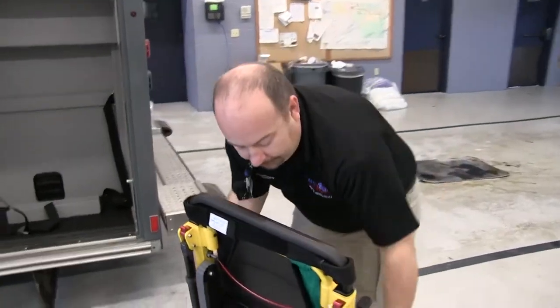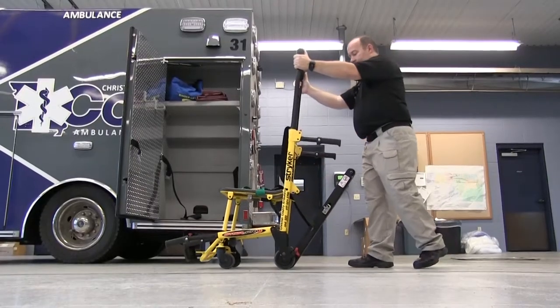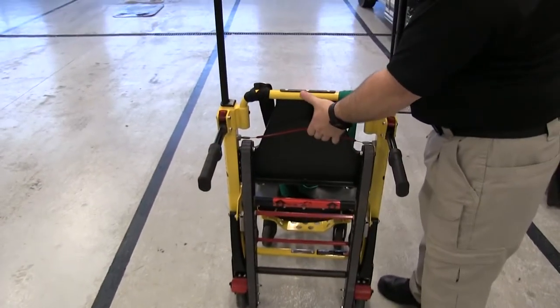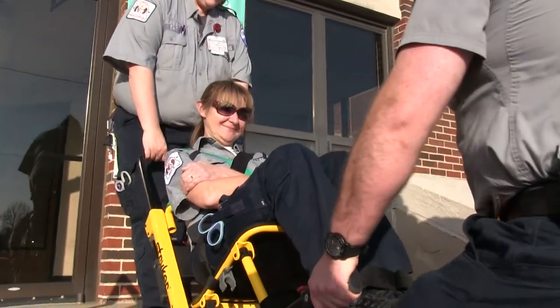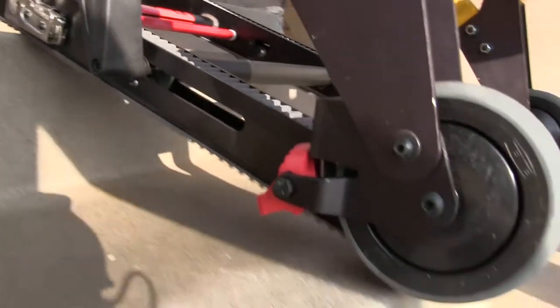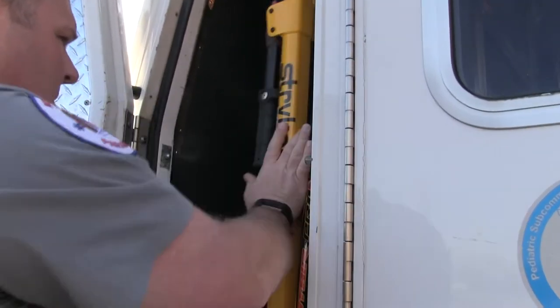It gives us quite a bit of versatility and movement. The Stryker Stair Chair weighs about 30 pounds, with a weight limit rated at 500 pounds. The upper arm provides better control while moving the patient down the stairs, with different locking positions for operator control, reducing risk of injury and ensuring patient safety. The handles at the foot of the chair extend for better control going down the stairs. The stair tread on the back allows the chair to safely crawl down stairs so you don't have to lift it, reducing injury risk for the crew. The chair is designed for compact storage and easily fits in our ambulance.